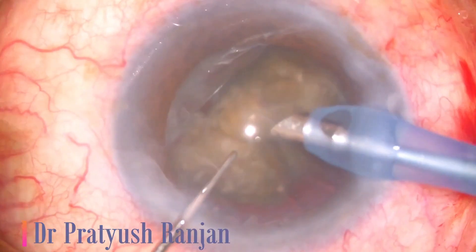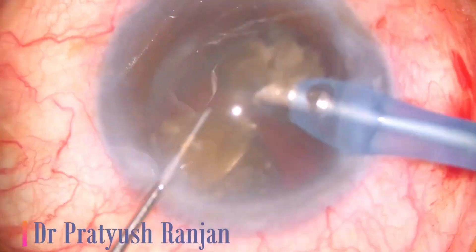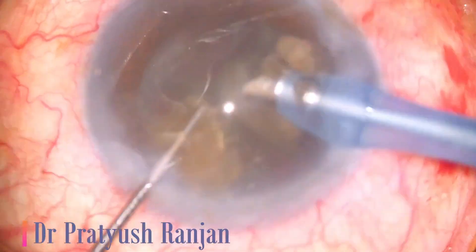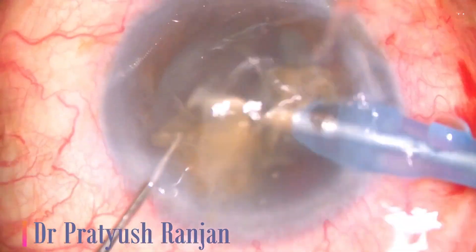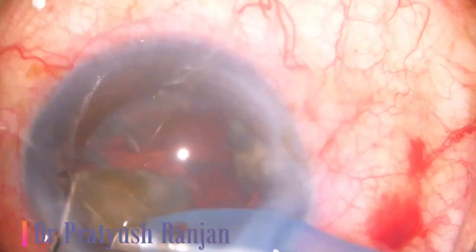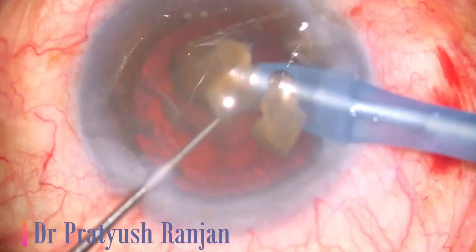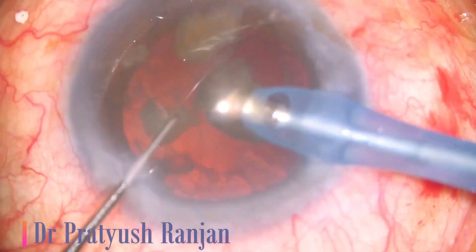I have done more than approximately 30,000 surgeries with this technique, with absolutely flawless results. Not much effect on endothelium — in fact, none. All my patients see very fine immediately after surgery, and next day they are absolutely very independent from that eye. Thank you very much for patiently watching this video.